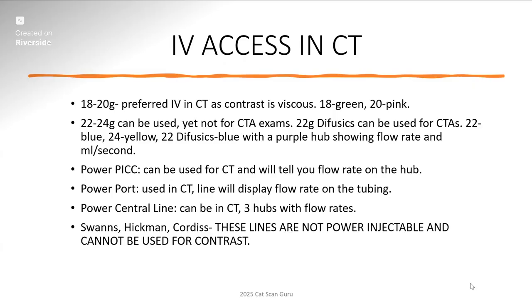You can call the reps and get the literature. Even the packaging will tell you exactly. These are lines where they slam a bunch of fluids, but that's hand pushing. Power injecting is at a very strong force. We're talking about 300 PSI, that's pounds per square inch. So do not use these.